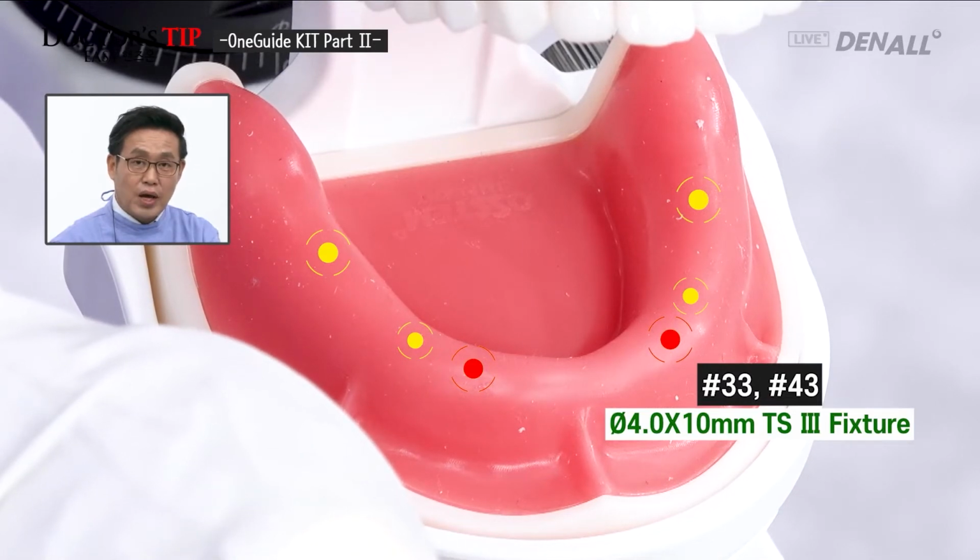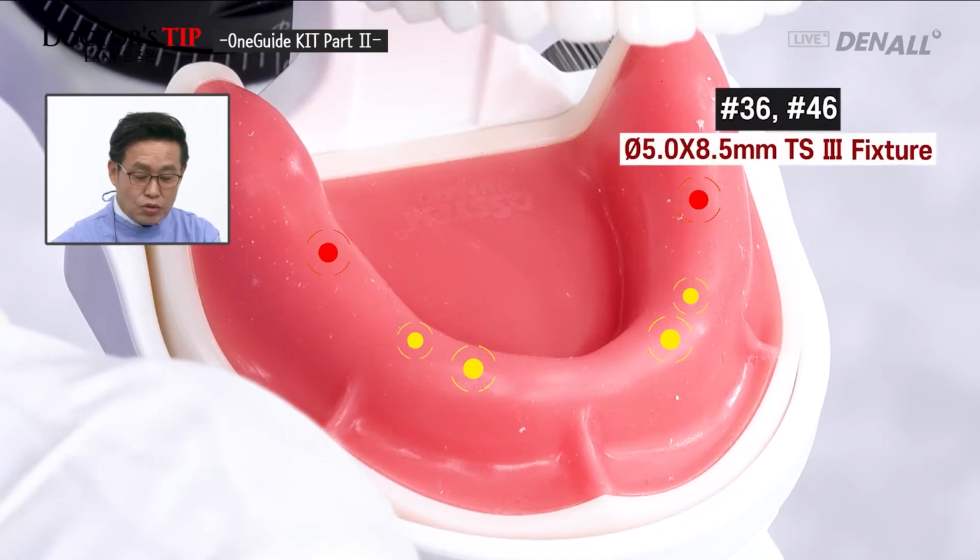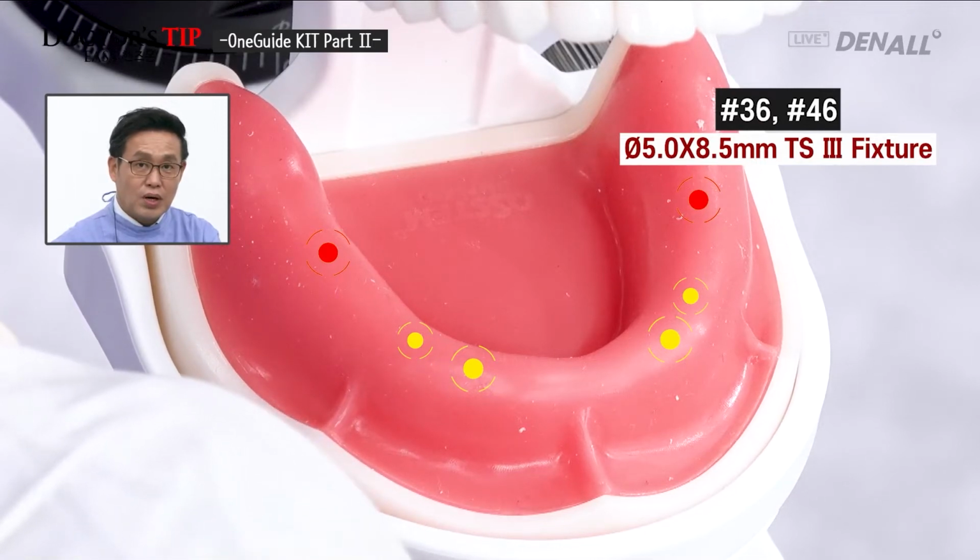TS3 diameter 4.0 by 10 mm implant is going to be placed, and on number 4, 4.5 by 10 millimeter on both sides. And for number 6 on both sides, diameter 5.0 by 8.5 millimeter implants are going to be placed.